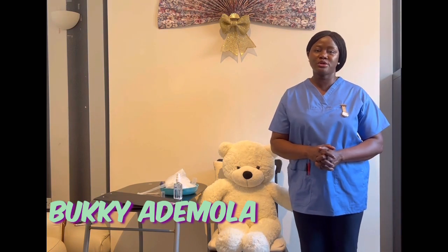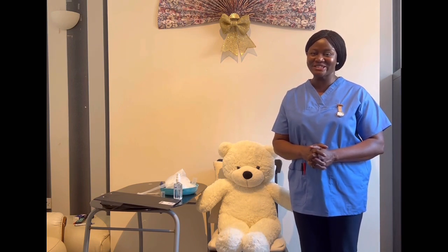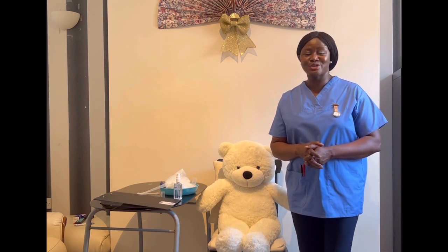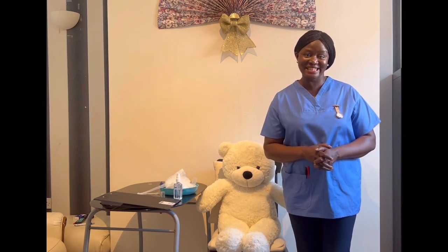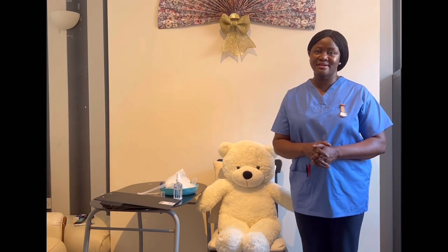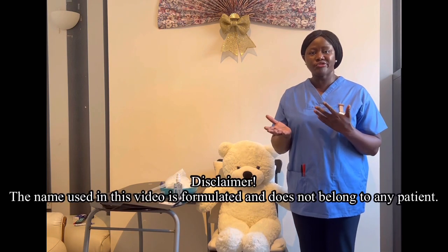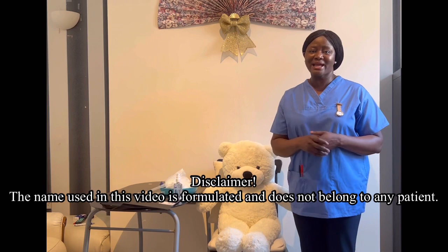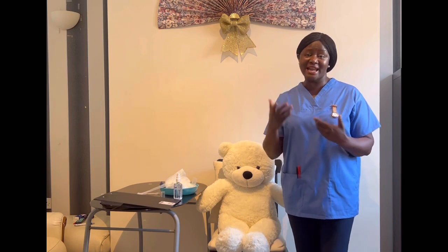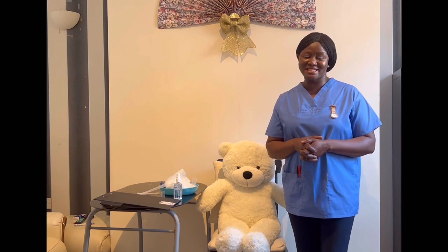In this video, we're looking at administration of inhaled medication, AIM, A-I-M, which is one of the skills you might encounter in your OSCE exam. The allotted time for the skill is 12 minutes. Even though it is a skill, the protocol for implementation still applies, because we are administering a form of medication through the inhalation route.